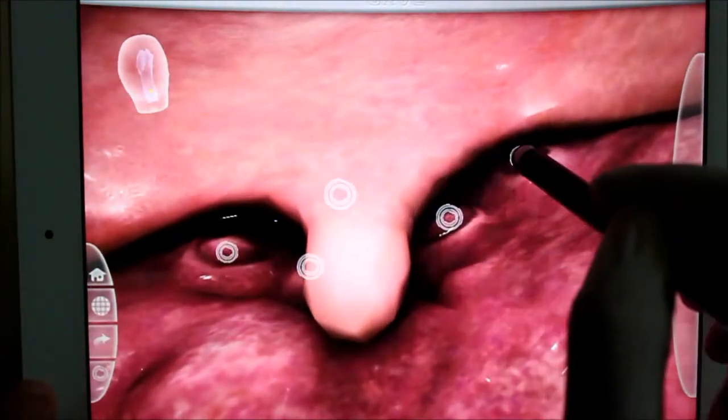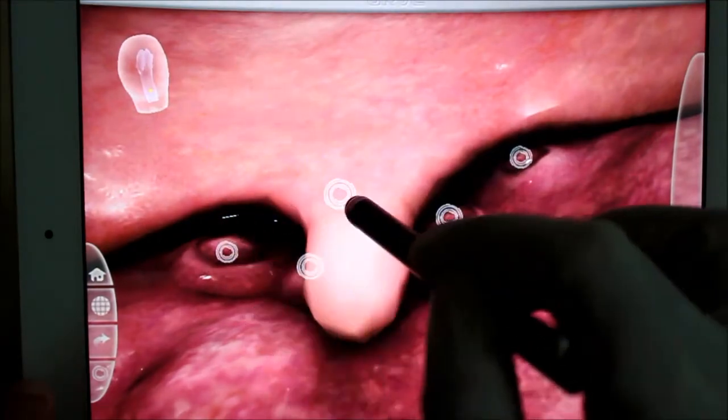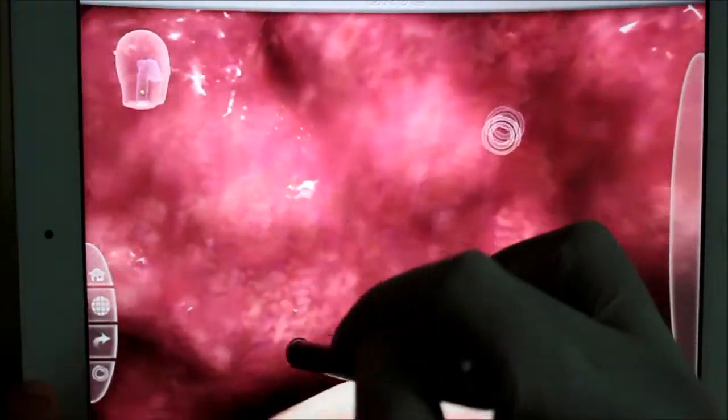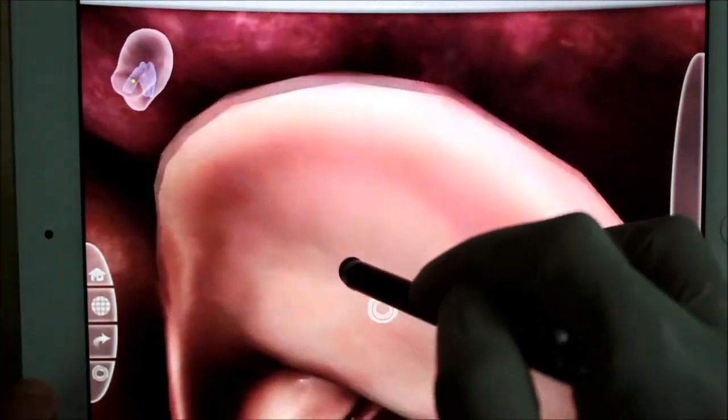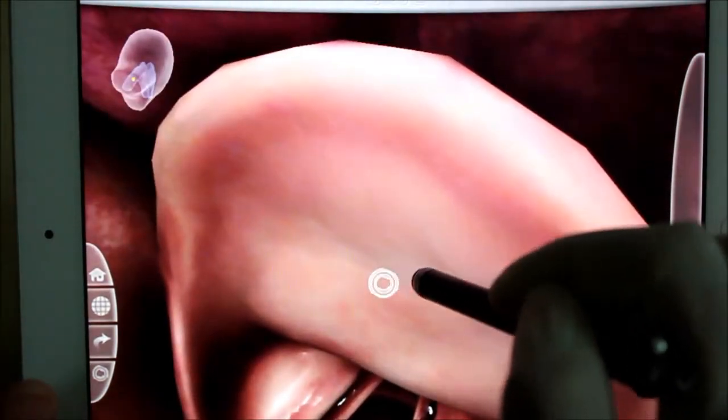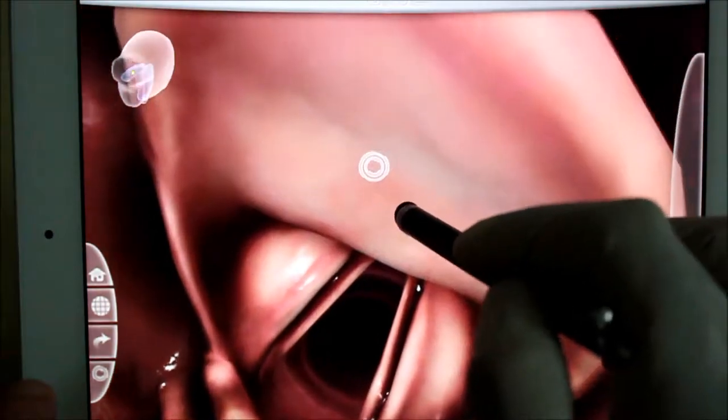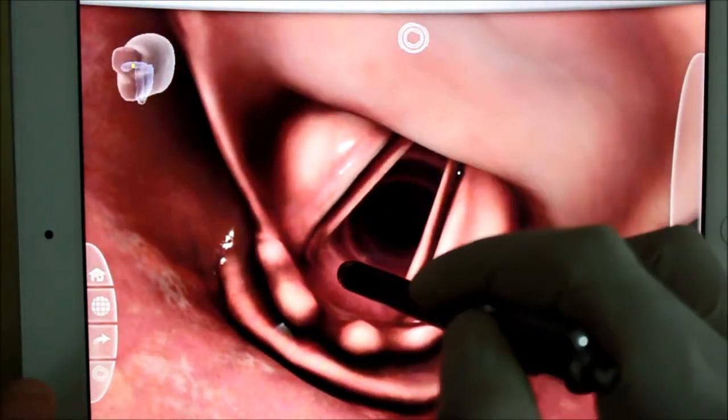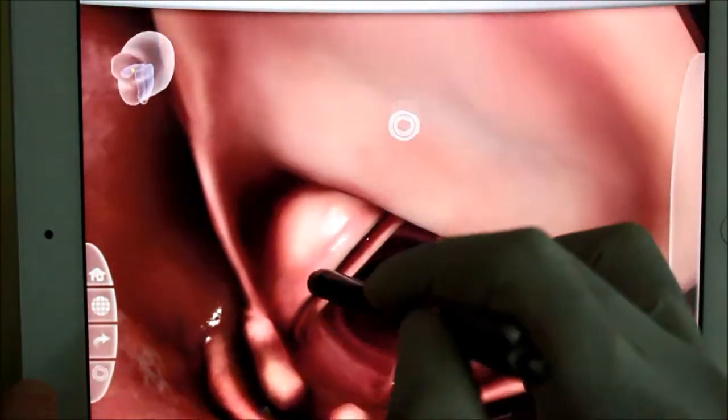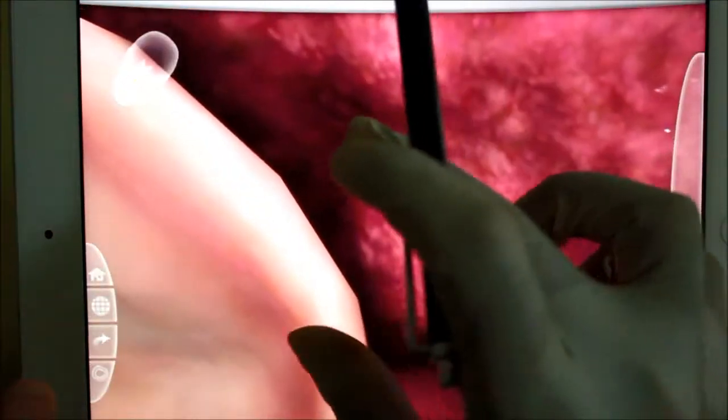we can see here the dorsum of tongue with circumvallate papillae. I hope you know the types of papillae on the tongue. Now going more deep we can see here the epiglottis.